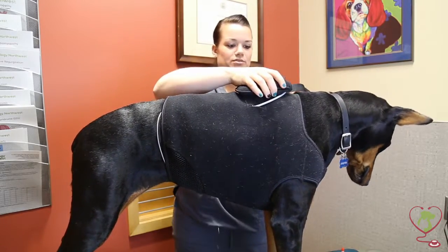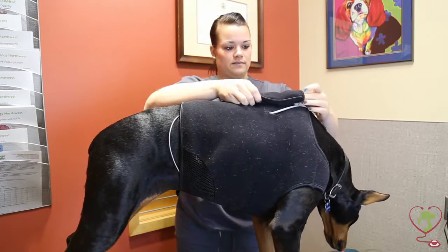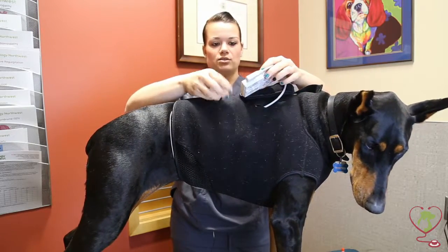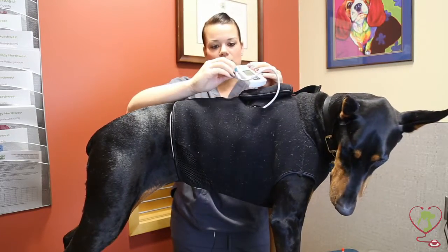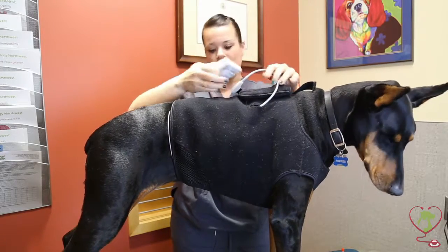Then you'll want to remove the monitor from the pouch. Your monitor will still be running, but you can unclip it and it should be fine. You just want to unplug your wires from your monitor and keep them all together.